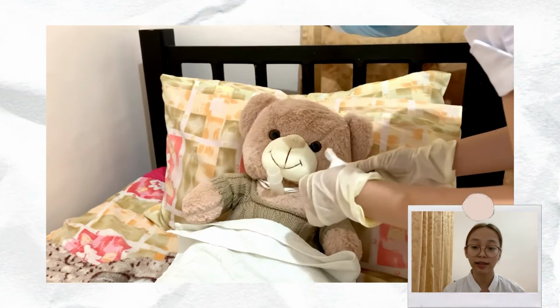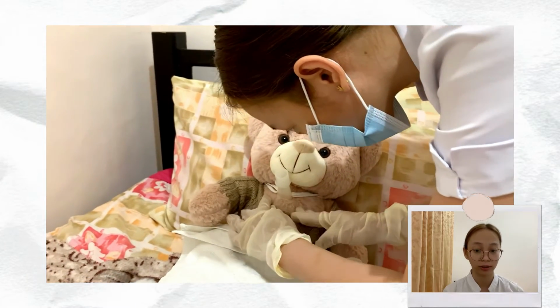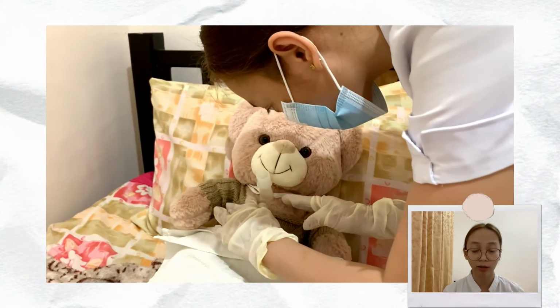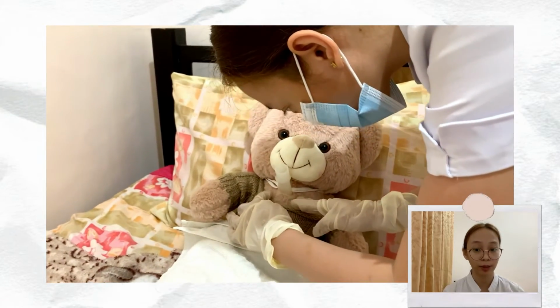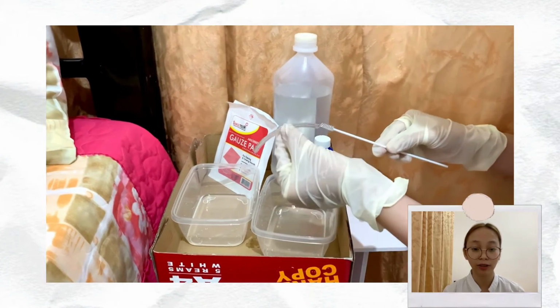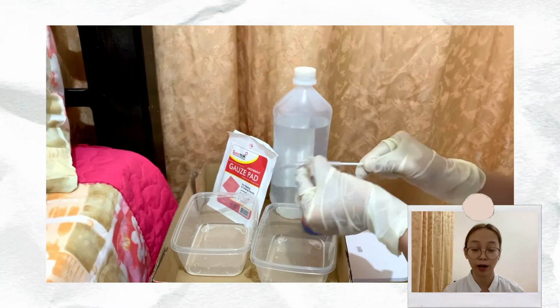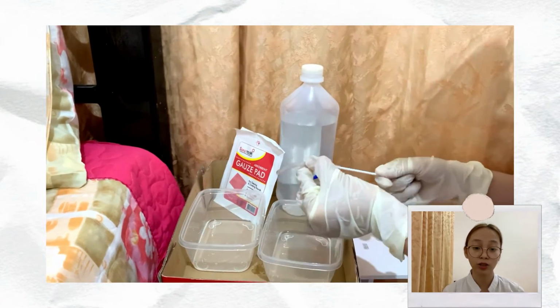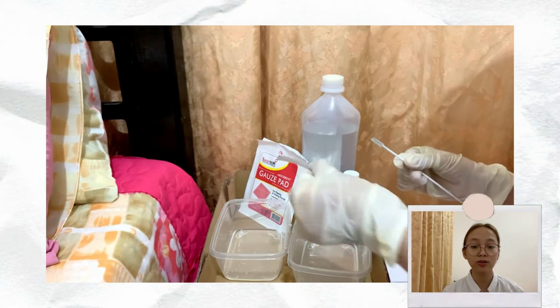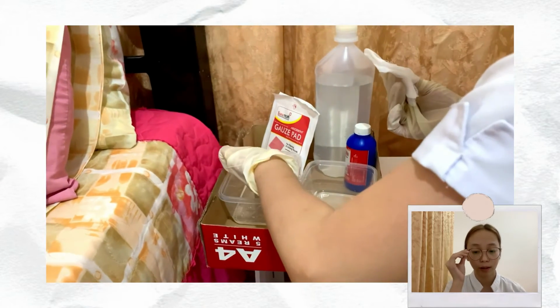Simultaneously, gently slide the trachea pad or dressing downward and discard. Check for some exudates or drainage, skin breakdown, irritation, and inflammation. Number 15, clean the inner cannula of the trachea tube using the prepared plain NSS and hydrogen peroxide, and use a brush to remove solidified or sticky mucus. Rinse using the second basin with plain NSS only.